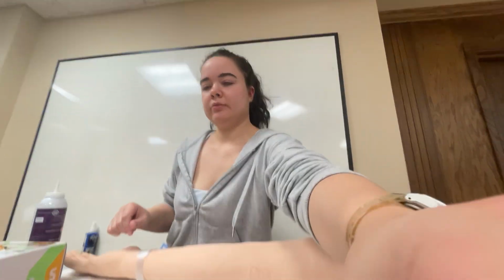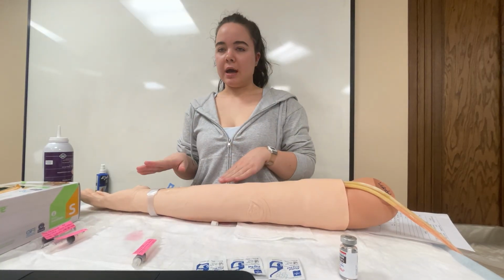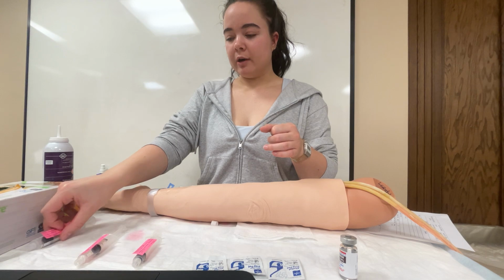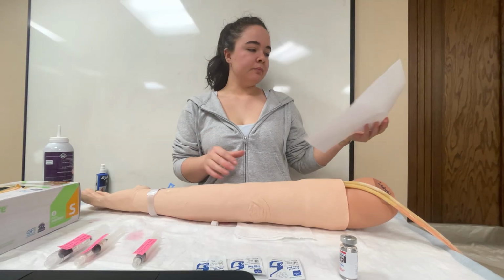So I'm going to go ahead and scan my medication over here. Beep. This is my med. Beep. Okay, that's scanned. I already have my vials over here. They are all labeled. The labels may come off because they're not very sticky. But I have all of that prepped. I have my MAR over here.